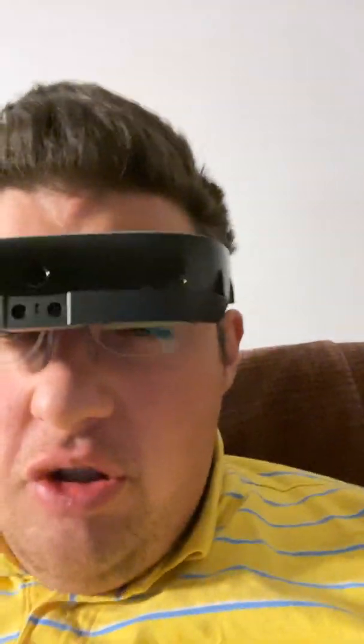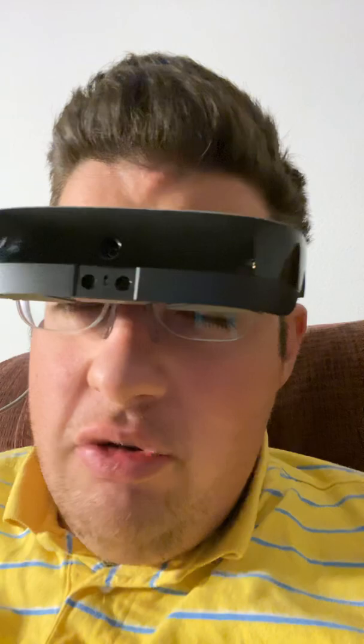Hello everyone on YouTube, Ben Murray here with you, glad to be here. I wanted to come back and give you an update on how things are going with my eSight glasses. I know it's been a year since I uploaded a new video, so I thought it was time for a new one.